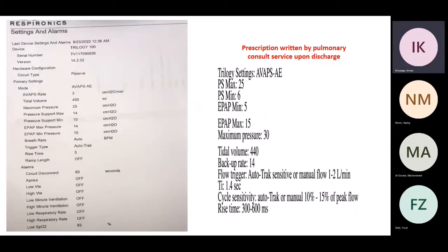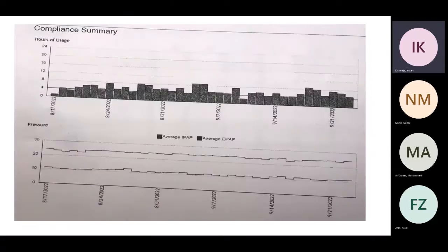The point here is that this is a sign telling me this patient is reaching the maximum of her pressure support every time. So without showing you the next slide, just by looking at this, I see the patient is reaching the maximum pressure support each time.